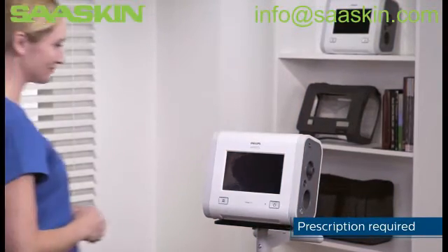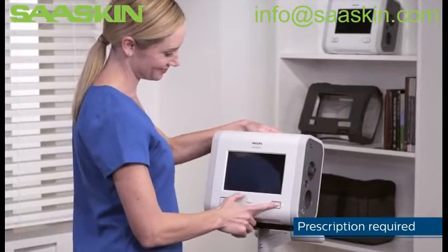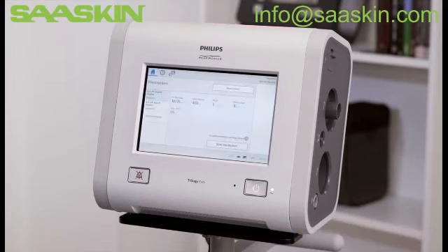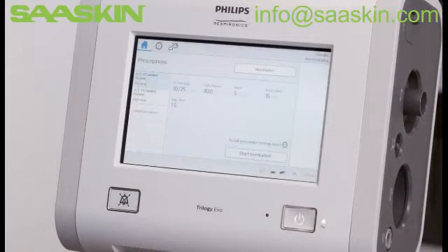Trilogy EVO has been designed with an easy-to-use touchscreen interface. In this video, we're going to demonstrate window navigation and some important functions, including Info Help, Battery Information, Monitoring Views, and Changing Prescriptions.